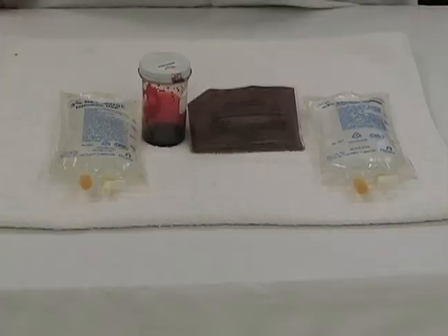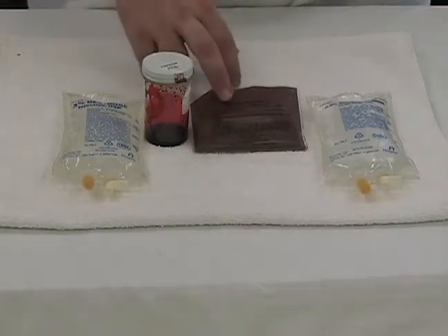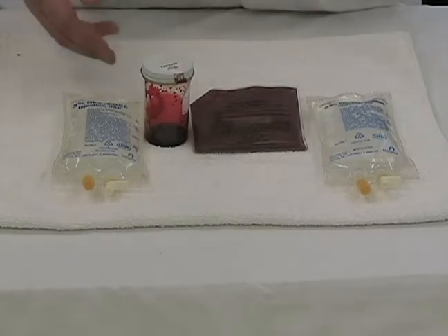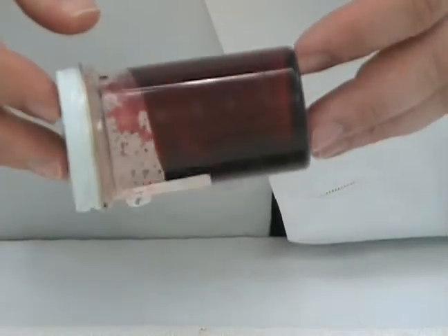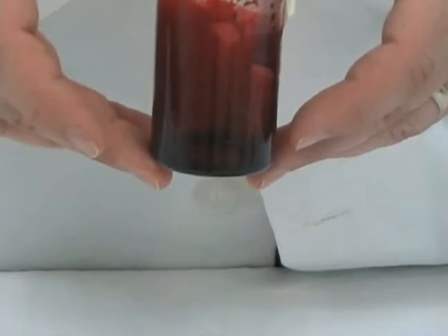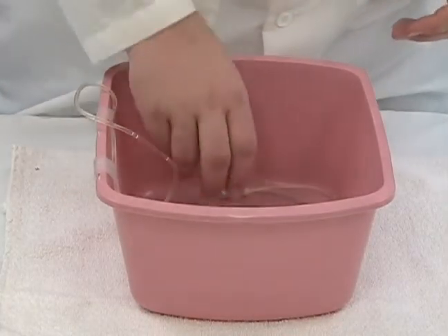There are a variety of different blood products on the market. Here at the Rhode Island Hospital Medical Simulation Center, we prefer to make our own blood. We use the simulated powdered blood concentrate and mix it in a specimen cup using equal parts dextrose and sodium chloride. We find that this gives us a nice consistency. As you can see, it coats the inside of this cup, and it also coats the inside of a chest tube.